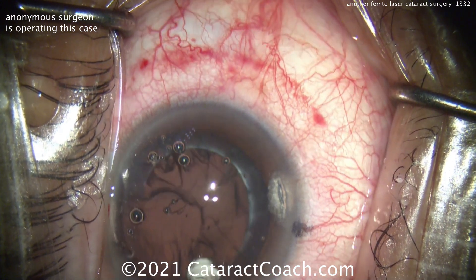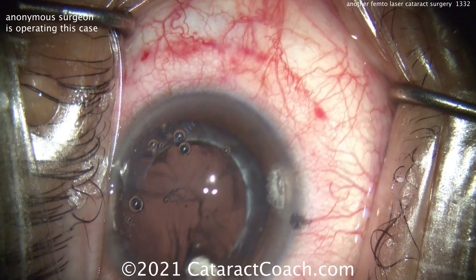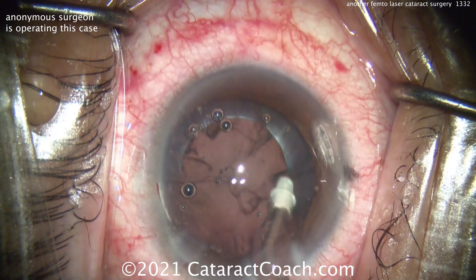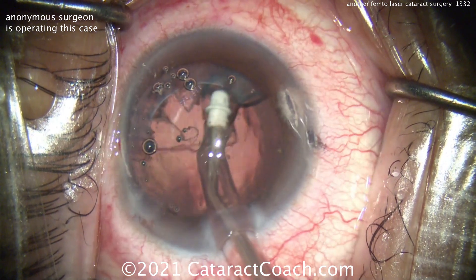Now, patients sometimes love the word laser — anything laser sounds good to them. But really, it doesn't make a huge difference, and studies have kind of borne that out over the last decade or so.